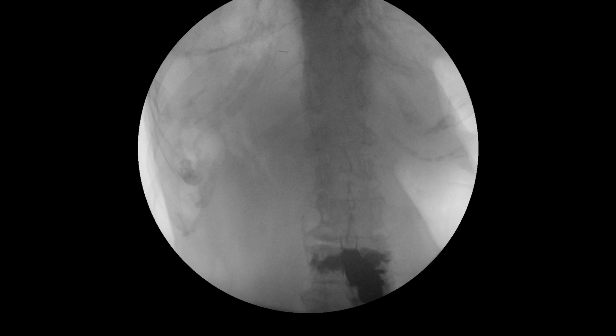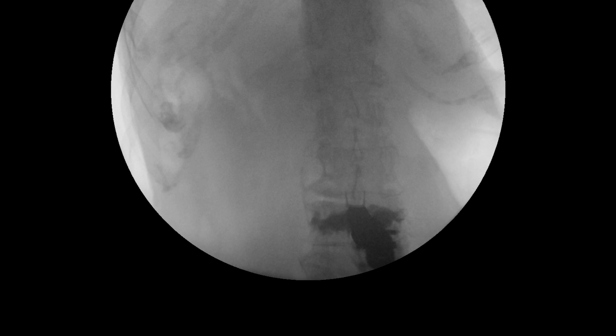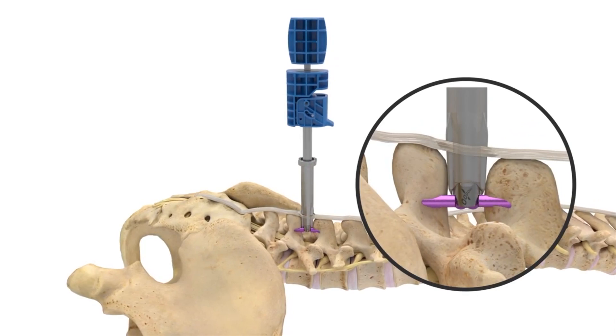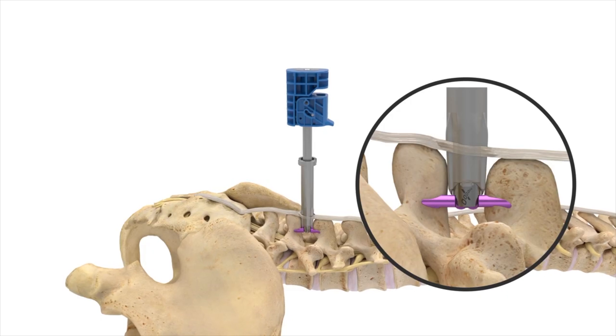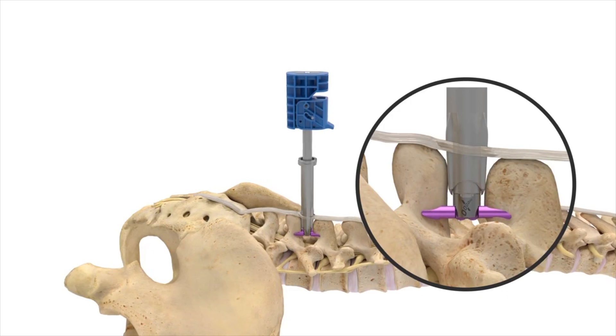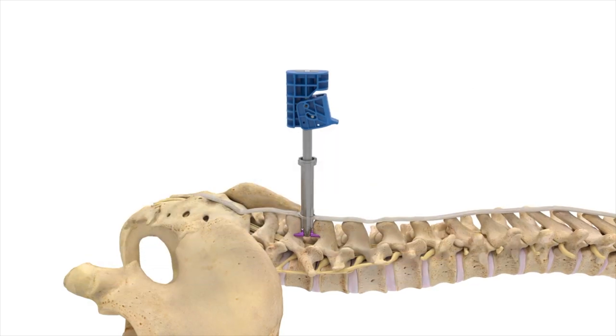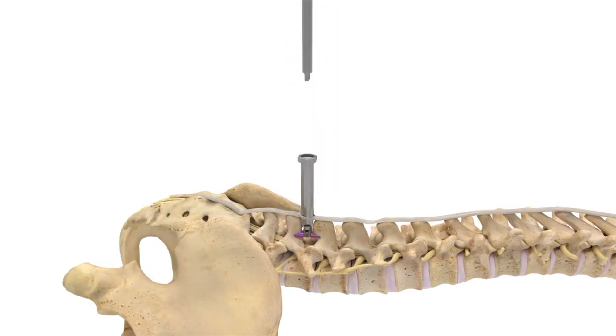In the AP view, the cam lobes of the implant should be seen containing the adjacent spinous processes. The implant should then be driven ventrally with a mallet so that the superior cam lobes rest against the superior segment's lamina. After final positioning, the lever is rotated upwards to deploy the implant and the inserter and cannula are then withdrawn.